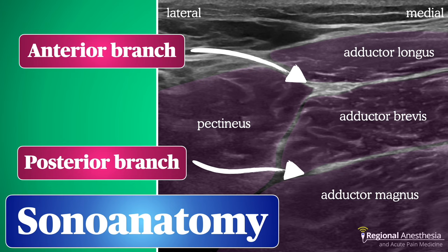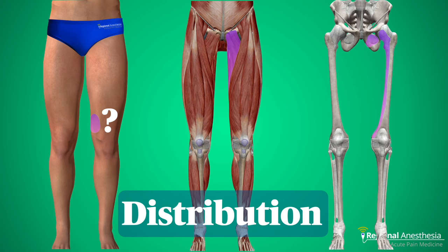To block these, we'll advance a needle from the lateral side and deposit local anesthetic in each of these planes. The obturator nerve innervates the medial femur, including the medial part of the femoral head and hip joint. Because of that, it's been promoted as a good block for pain relief following femoral neck fracture. There's also a small part of the ischium near the obturator foramen that's supplied by this nerve.